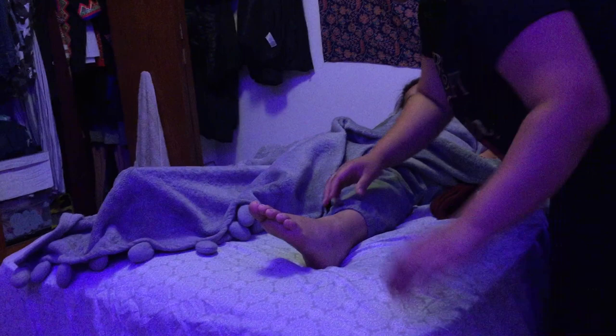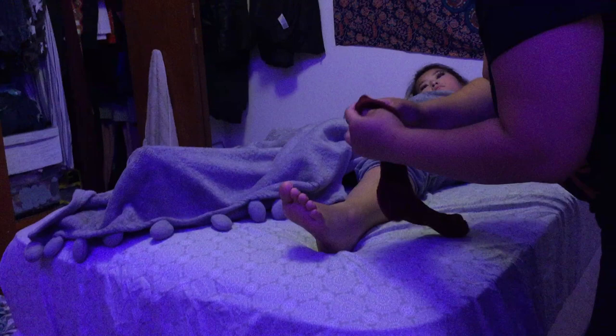Exposing one leg only. Just doing the same thing here — just extending this up, just to the heel part.